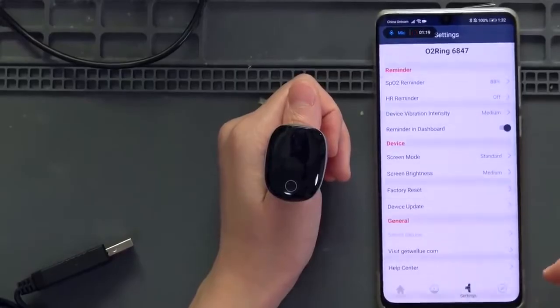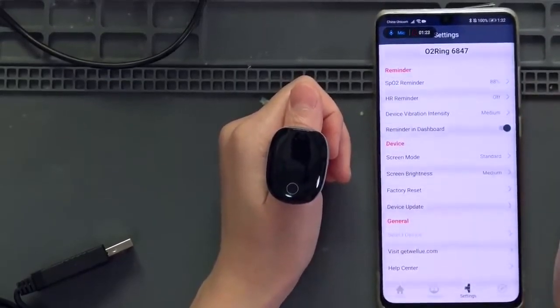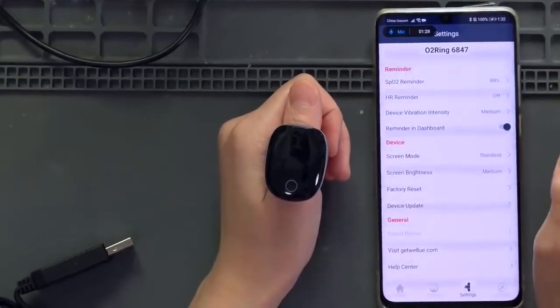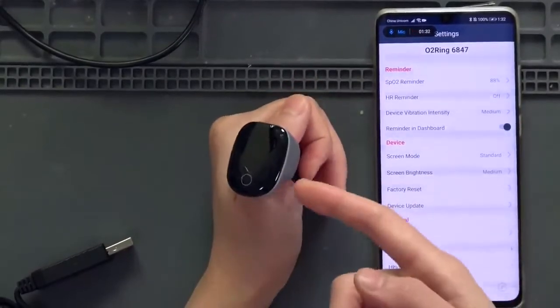In settings, there is a reminder so you can set a threshold — when SPO2 drops to 88%, it will alert you. There is a vibration alert inside the device.